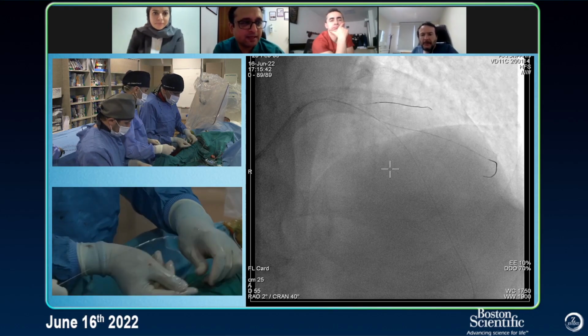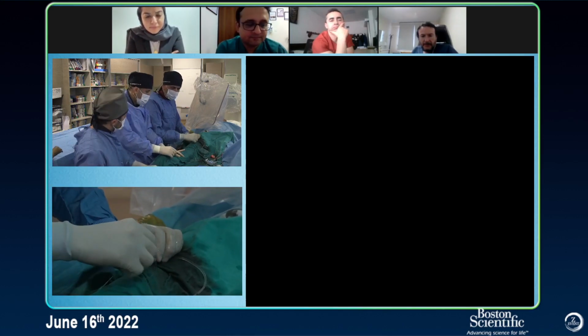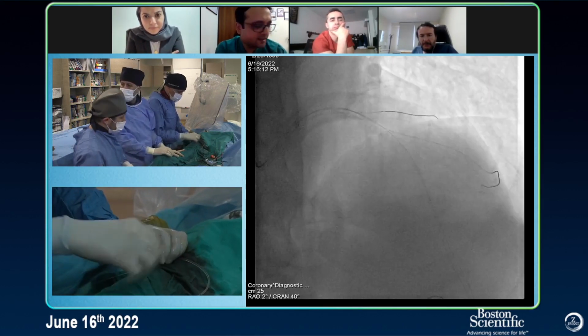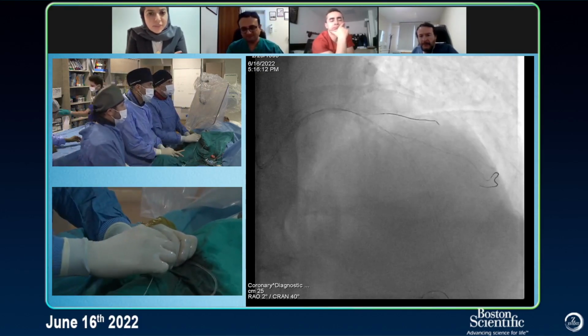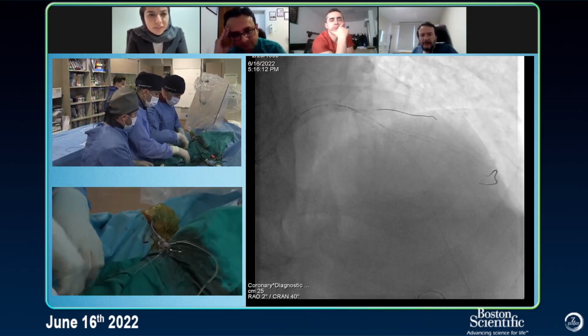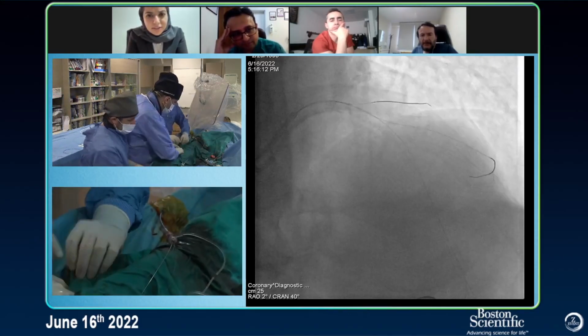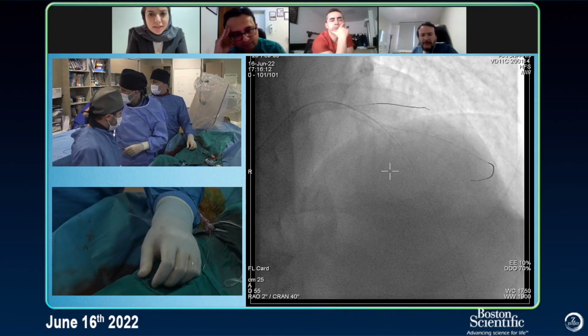All right, okay, let's give me 2.5 balloon. 2.5 balloon, yeah. Once you deal with that diagonal, see if you have time to show us an IVUS run.